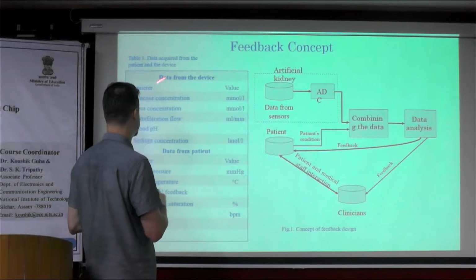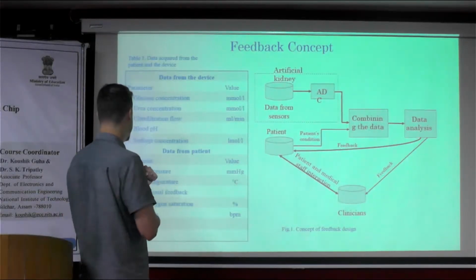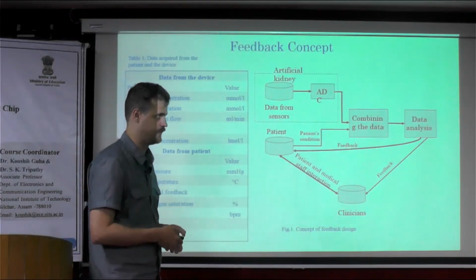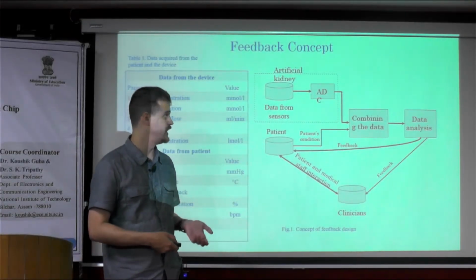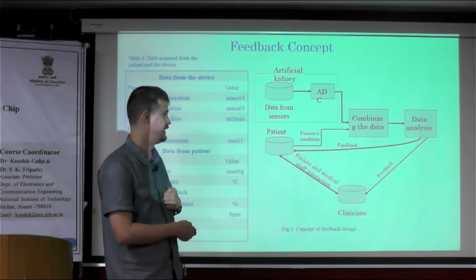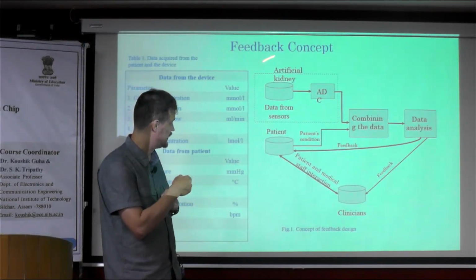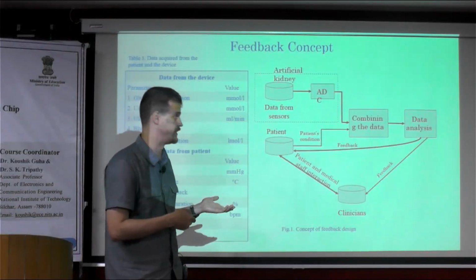It's not just that we have to control the molecular parameters of the blood. We also have to control the state of the patient himself. So the patient has to provide feedback to the clinician. We collect data not only from the device, but also from the patient and the state that he experiences right now.